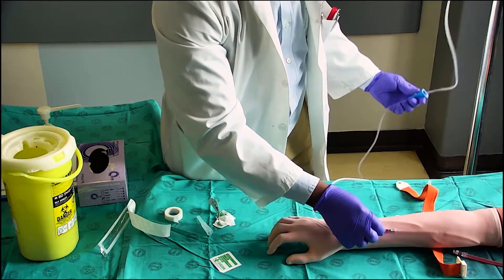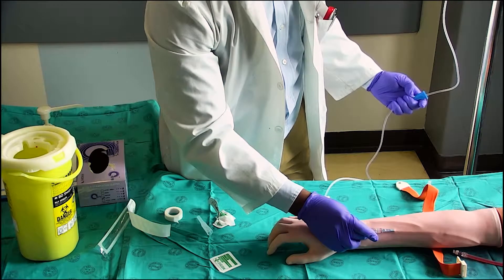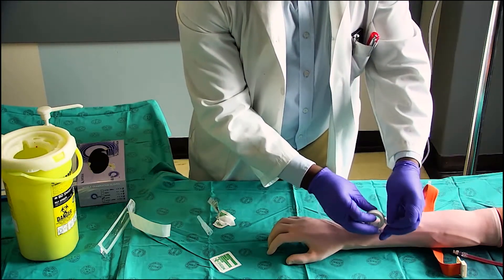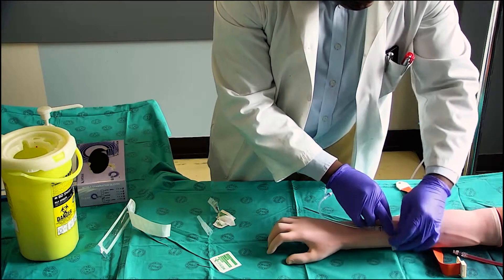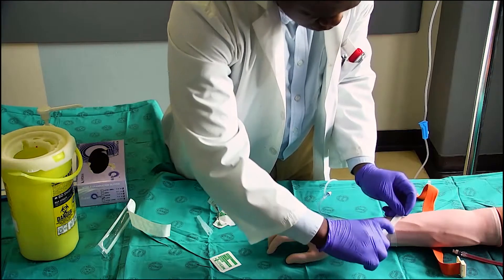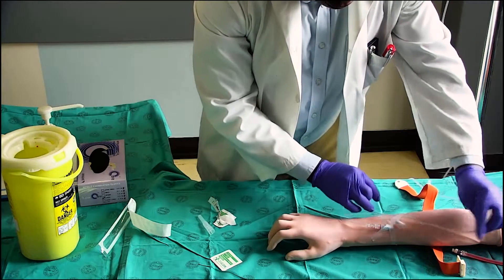Open the tap and check if fluid is dropping in the drop chamber of the set. Secure the cannula in position with the tape plaster. If needed, you can also secure the tubing with tape.